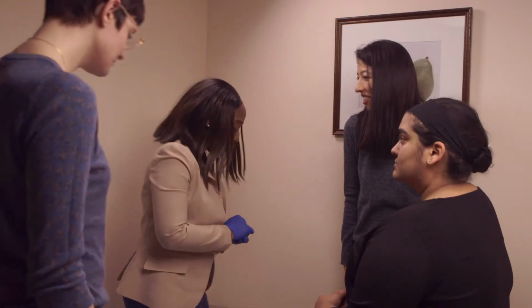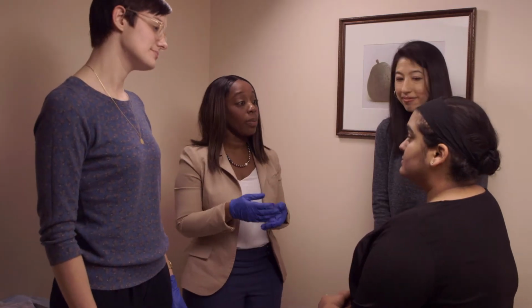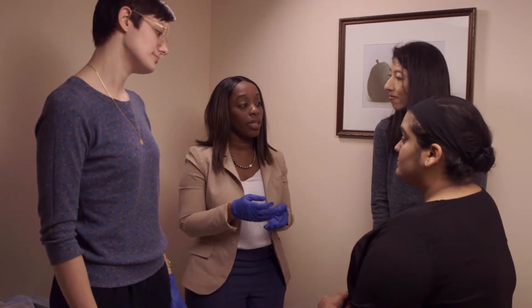Okay, Anjali, so before we start the procedure, I like to ask the patients how much they want to know. Do you want me to talk through each step, or do you prefer that we talk about something else? I think I would like to know each step as it happens. I just don't want to be surprised by anything. Sure, we can do that.